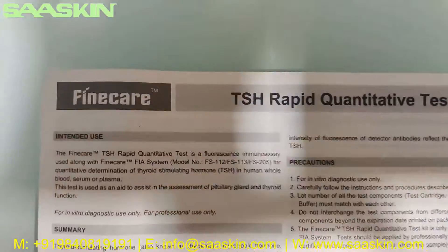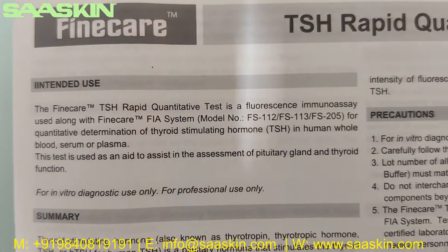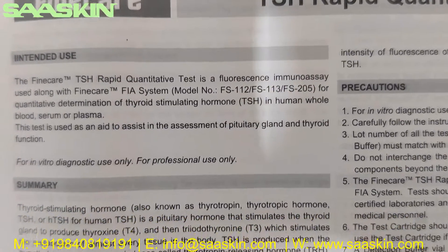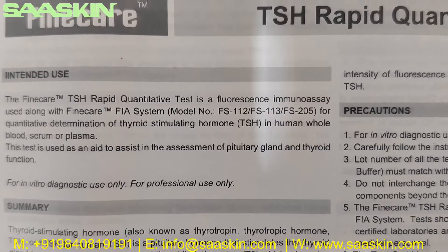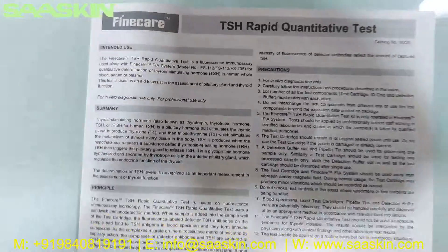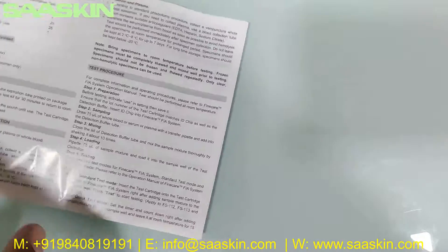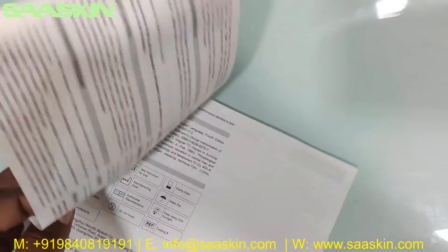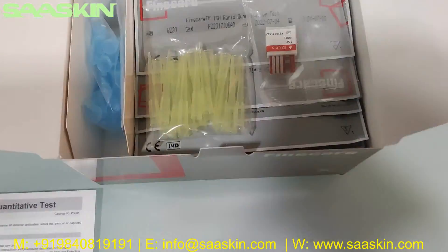This is the Finecare TSH Rapid Quantitative Test leaflet. The Finecare TSH Rapid Quantitative Test is a fluorescent immunoassay used along with the Finecare system for quantitative determination of thyroid stimulating hormone (TSH) in human whole blood, serum, or plasma. This leaflet has complete instructions about the test procedure, test method, and how to interpret your results.